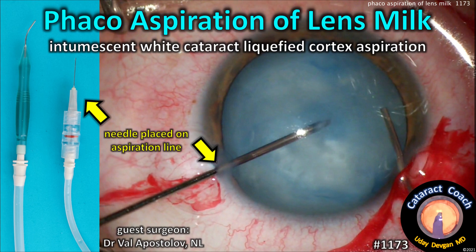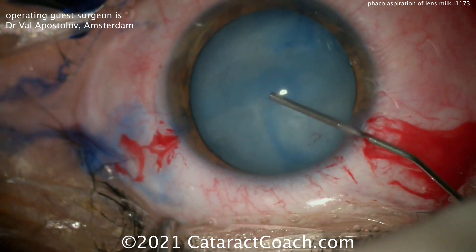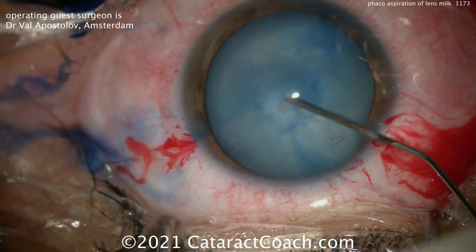cataractcoach.com — phaco aspiration of lens milk. This is an intumescent white cataract with a liquefied cortex. Here's how you can aspirate it. We've shown something similar before from a previous guest surgeon, but this is an intumescent white cataract.